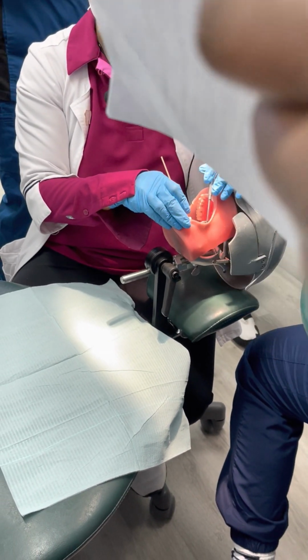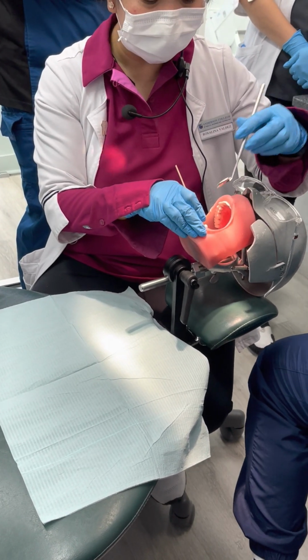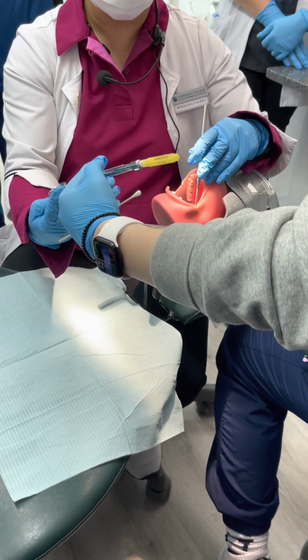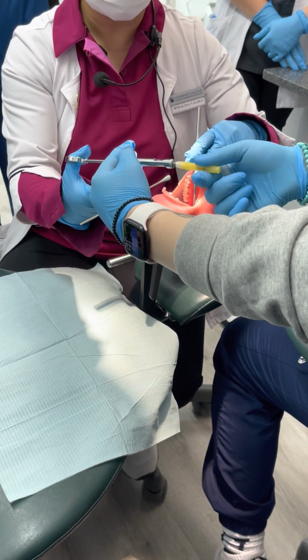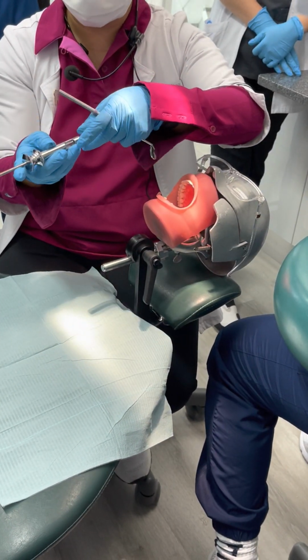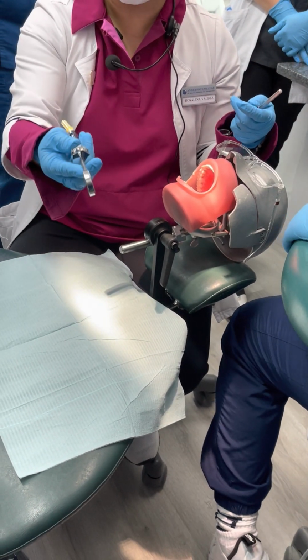So some dentists will just ask you to assemble that and leave it there and they'll take it from you, right? And some dentists like me, I'm lazy. I'll do it. I want you to work. Hold it properly. When you pass, if the dentist asks you to pass this, do not pass it like she's doing. Make sure you pass it like this.